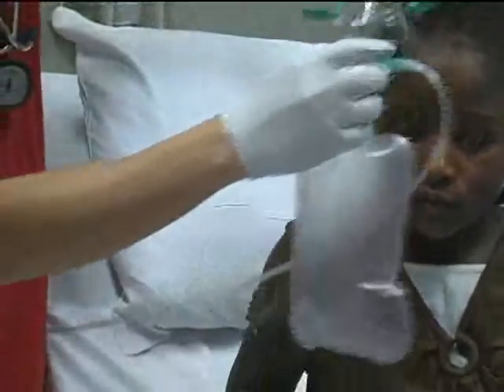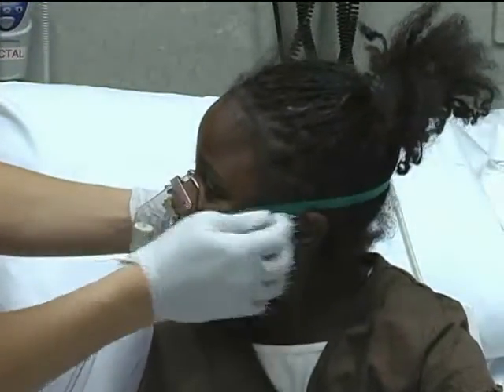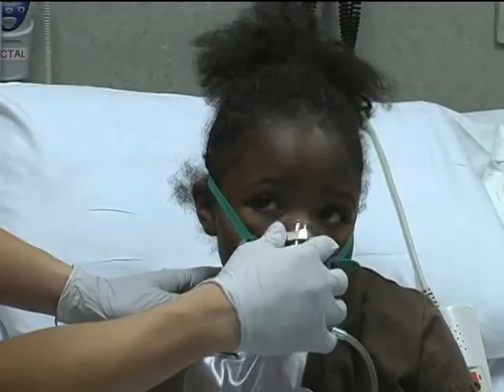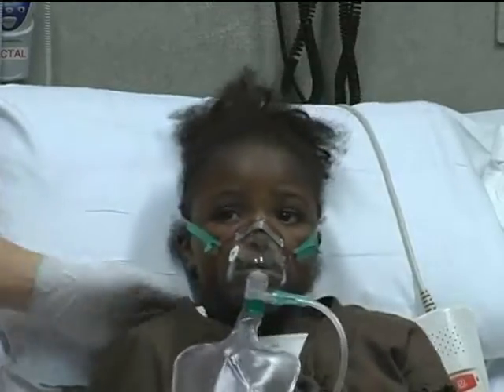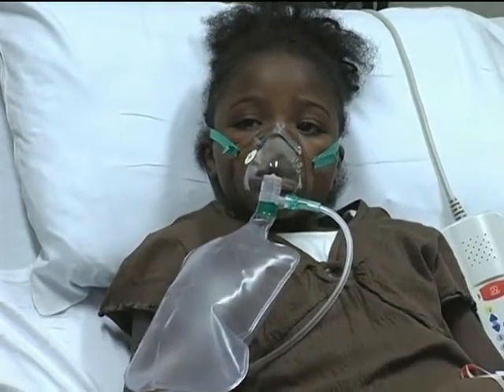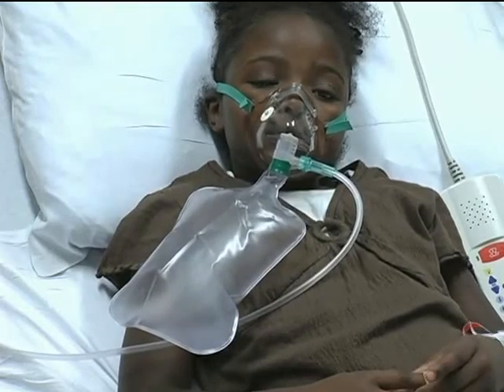A non-rebreather face mask is fitted in the same manner as a simple face mask. Fit the strap around the skull and use adjustable straps to fit the mask around the nares and mouth without obstructing the eyes or having the mask hang over the chin or jawline. The reservoir bag should be inflated and not collapse when the patient inspires. When fitted and connected properly, full non-rebreather masks can deliver oxygen concentrations of greater than 95%.